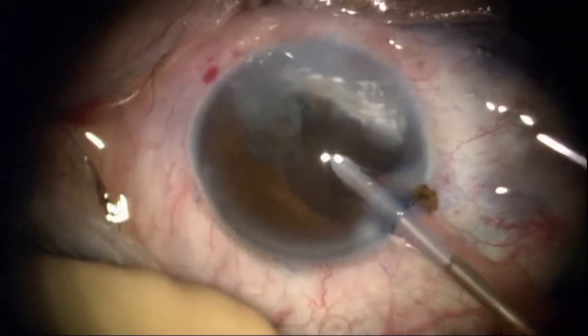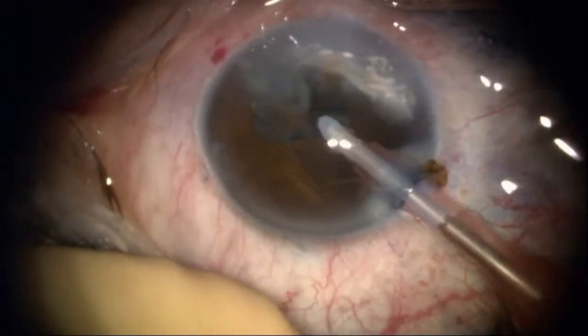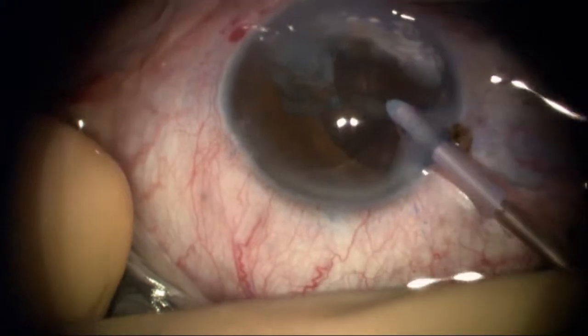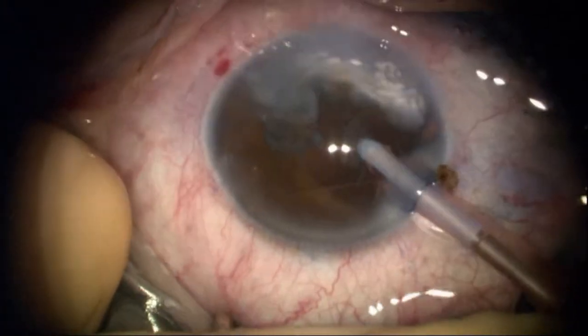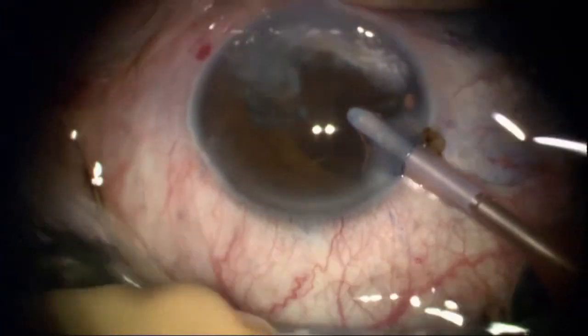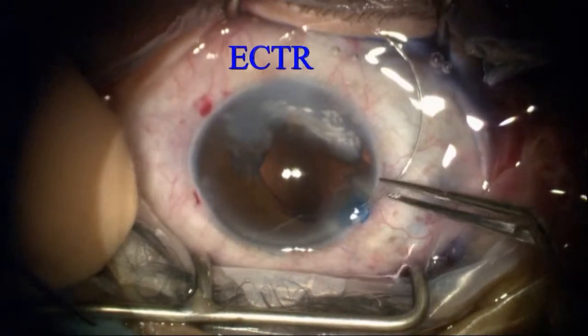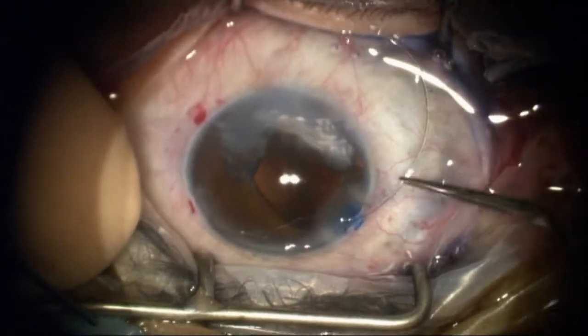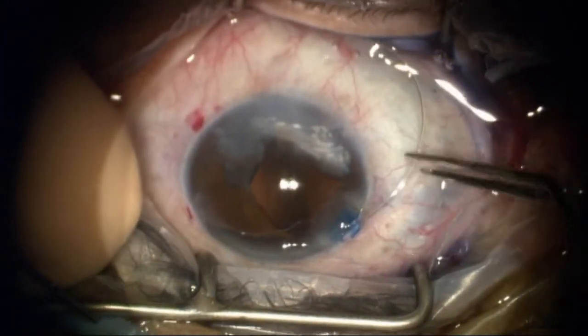Now here the cortex, starting with sub-incisional cortex where the remaining cortex can help keep the bag open. Visibility is somewhat limited, but I'm relying on my capsulorrhexis and hydrodissection to gain access to the remaining cortex. It's important to get complete removal here — you don't want any unwanted post-op inflammation, and you're going to have some of that anyway with all the synechia lysis.